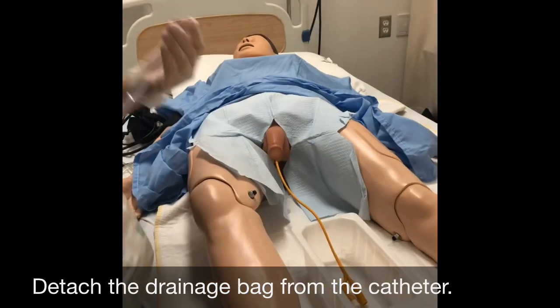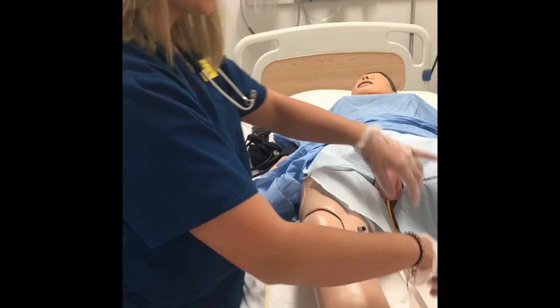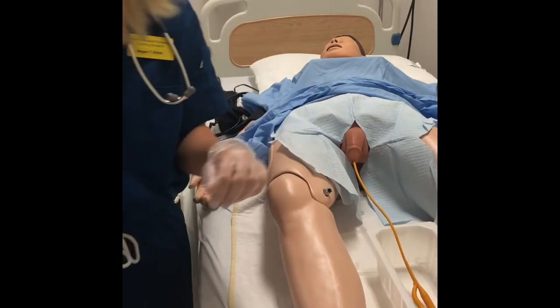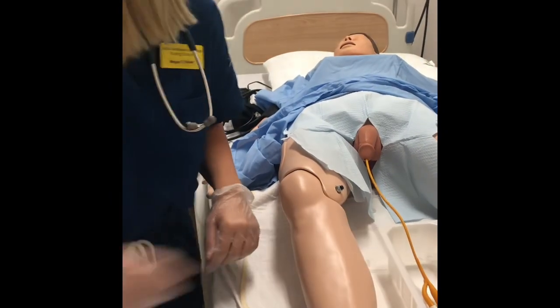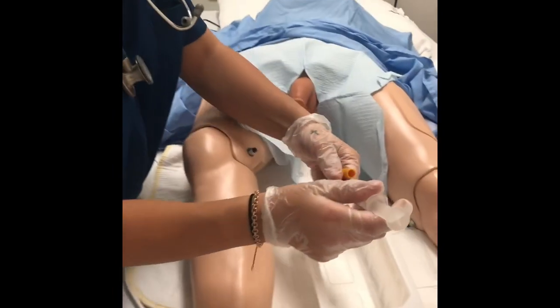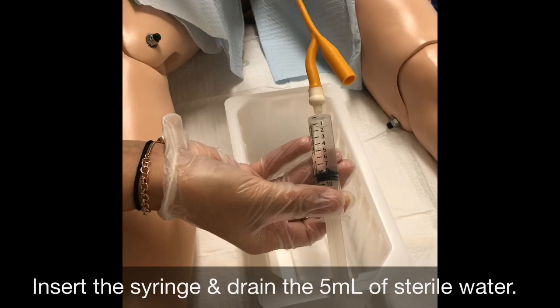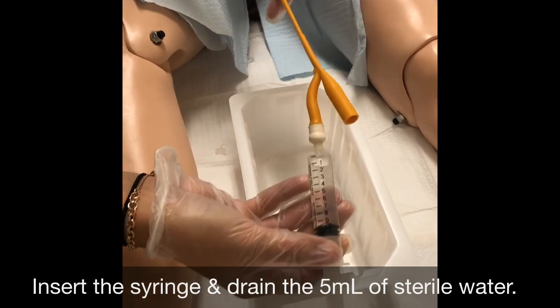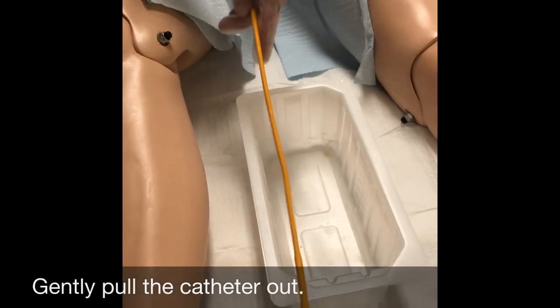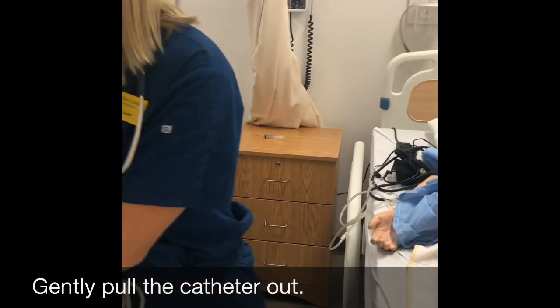So I'm going to disconnect this and dispose of it properly. So now I have the catheter running into this bin, and I'm going to grab my syringe, and I'm going to deflate the balloon. So originally I put 5 milliliters in, so that is what I'm expecting to get out. Okay, and I will gently pull the catheter out. Perfect, and I would dispose of that properly.